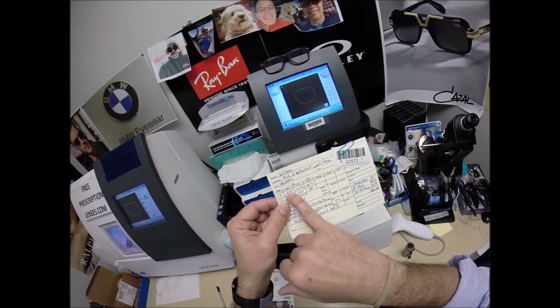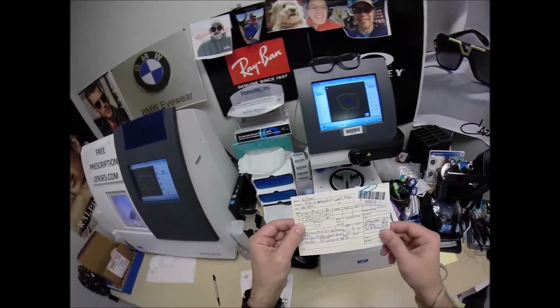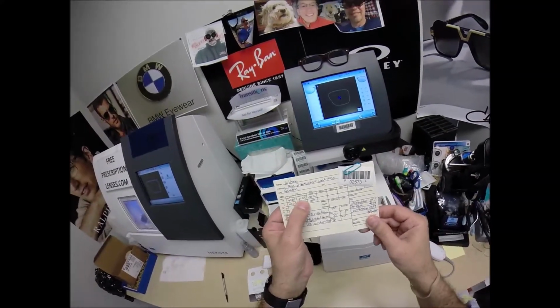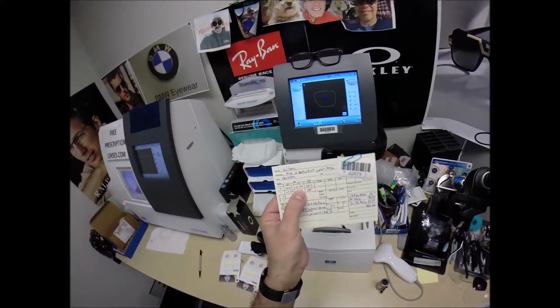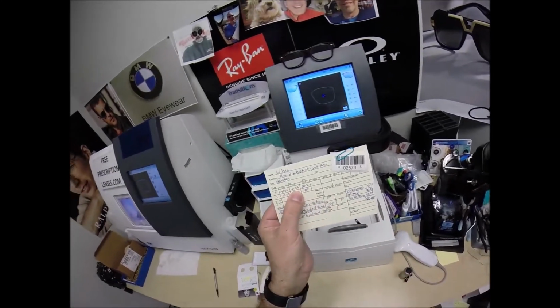Now, once everything is the correct size, with your glasses off, everything is ever so slightly larger than it appears, so it will shrink it down by 1 step, 1 minification to make everything the correct size. You have 1 step of astigmatism correction in your right eye. Your left eye, you have a full diopter, 4 steps. But now, 1 step and 1 step, you're on the second rung of a ladder.